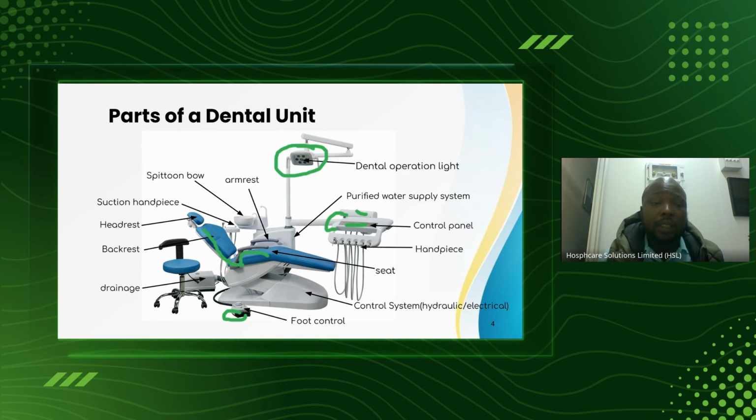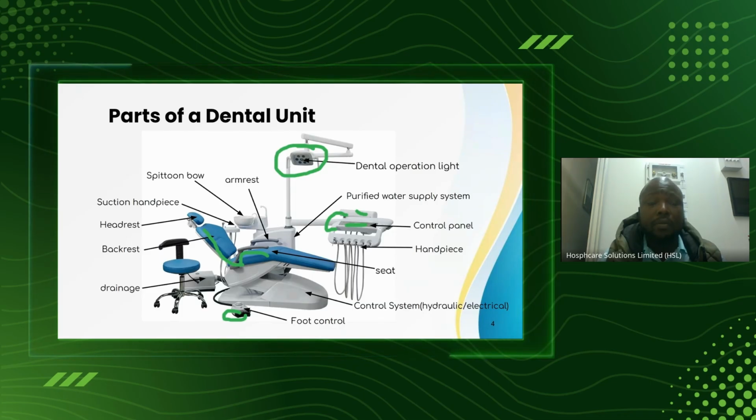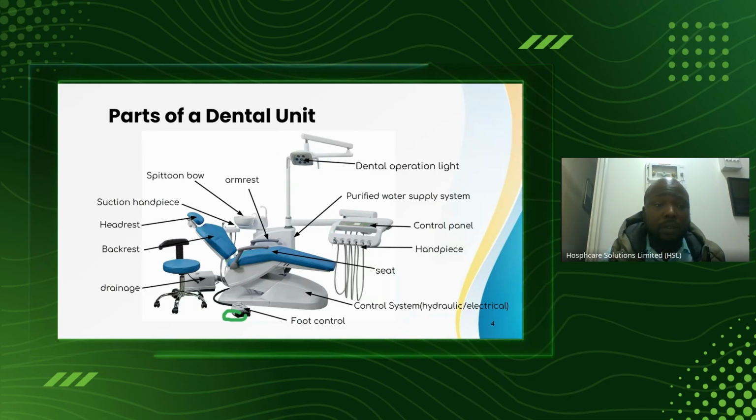But in some cases, it also has a control switch, so it functions like the control panel. The same function done by the control panel can be done with the foot pedal. It can operate the movement, activate or lock water, activate air, activate light, and so forth.